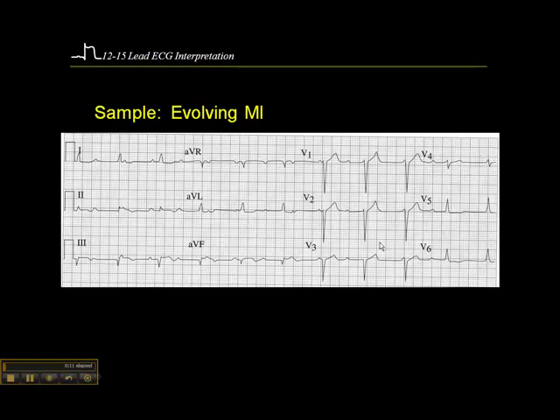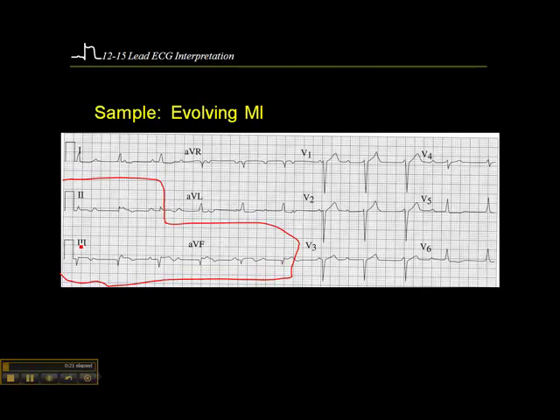We'll look at lead groupings. If we look at leads 2, 3, and AVF, what we see here is ST elevation and T wave inversion. Here we see a Q wave, ST elevation, and T wave inversion. And in AVF, we see Q wave, possibly some ST elevation, and T wave inversion.